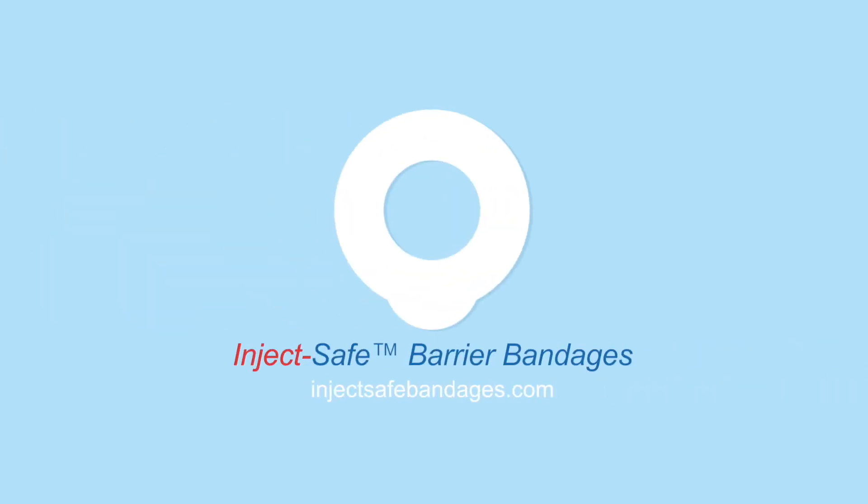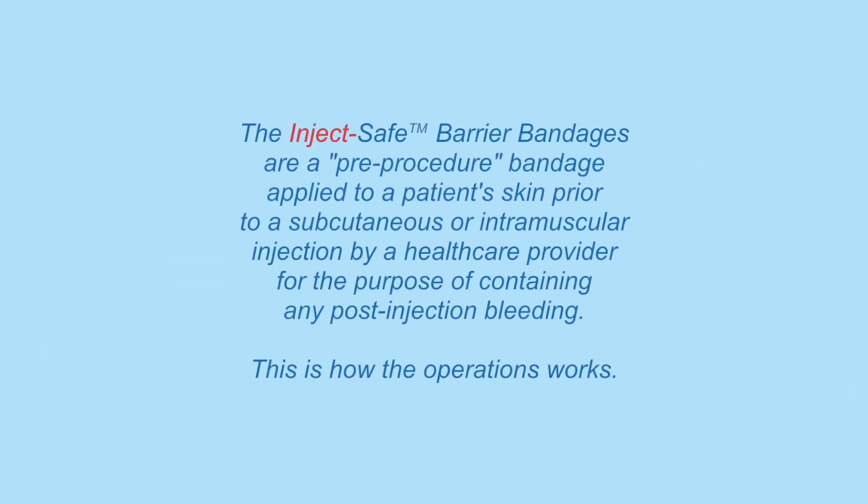The InjectSafe Barrier Bandage is a pre-procedure bandage applied to a patient's skin prior to a subcutaneous or intramuscular injection by a healthcare provider for the purpose of containing any post-injection bleeding.